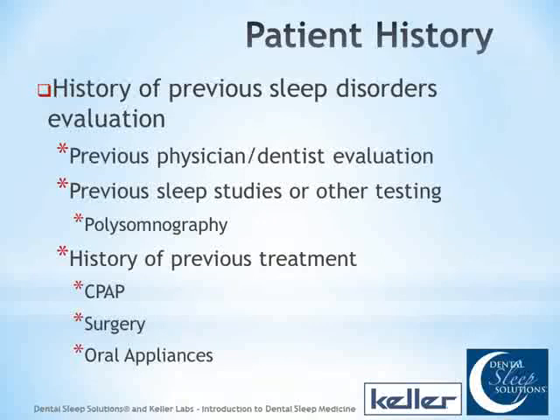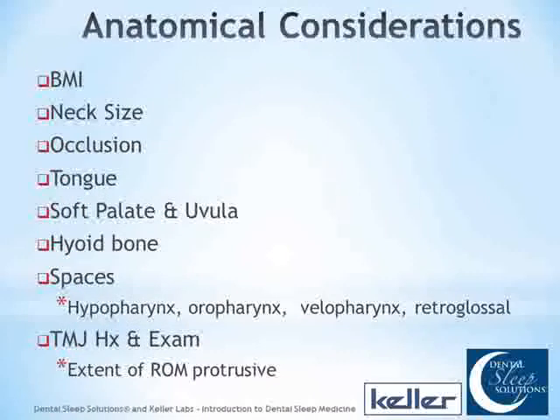I agree. Only thing I would mention is that if someone's had an over-the-internet boil and bite type appliance and they weren't successful, that doesn't necessarily mean they won't be successful with a custom-made dental appliance. Good point. For various reasons.